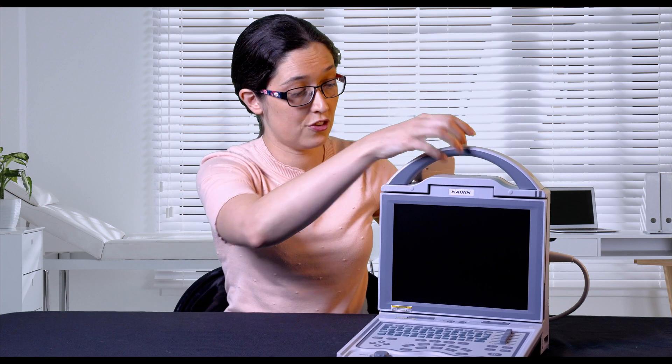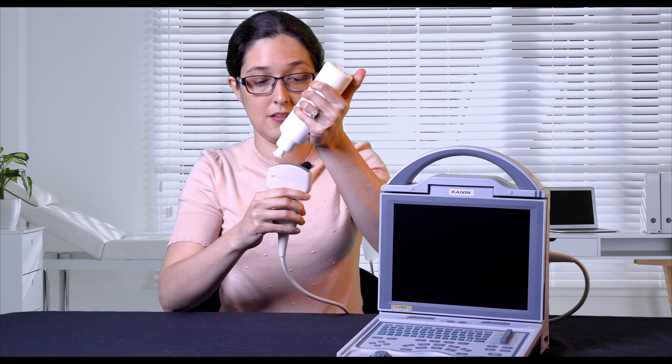Now to start scanning, peel the protective tape off the front of the transducer and apply your ultrasound gel. Enjoy scanning!